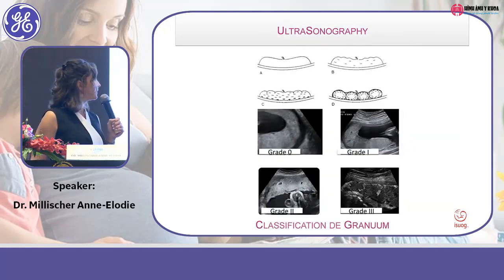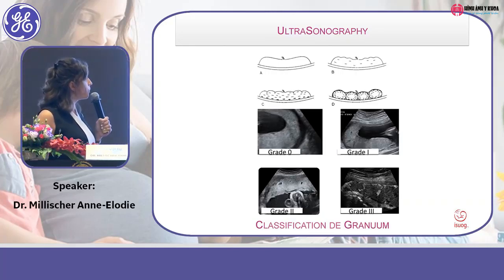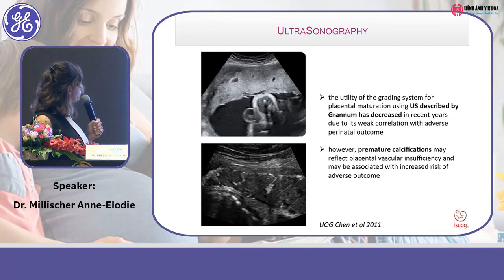The Grannum classification is done daily, but it is not very reliable to predict a dysfunction of the placenta.